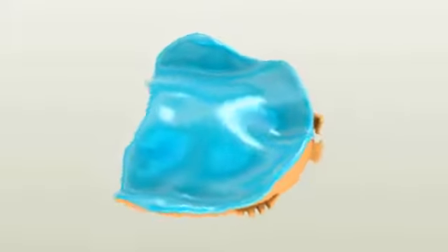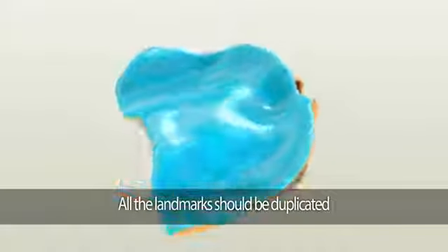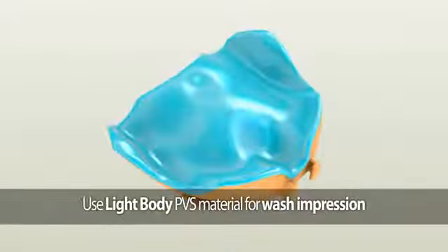If you see any plastic edges through the material, it means the tray is touching the soft tissue. If it does, simply remove it by using a slow-speed handpiece before taking the wash impression. The second area to check is whether all the landmarks are duplicated — this includes the post dam area, hamular notch, palatine fovea, incisive foramen, and the frenum areas.